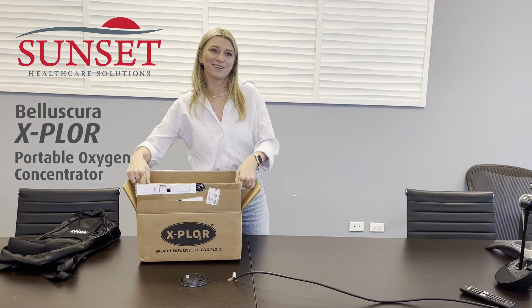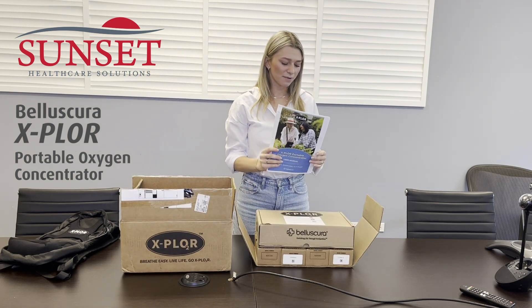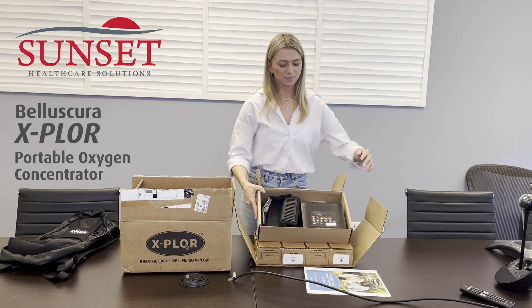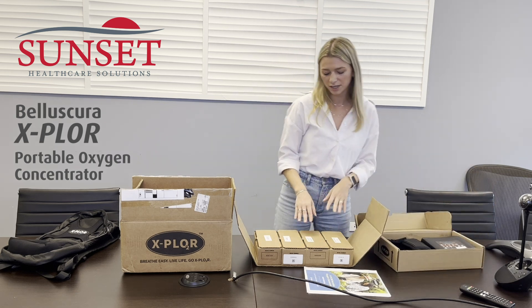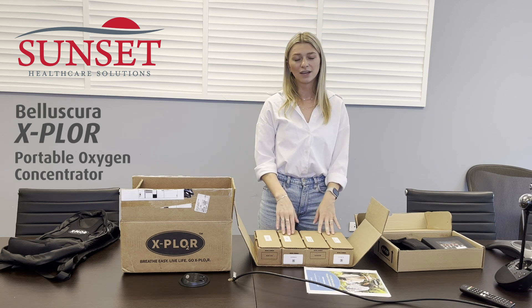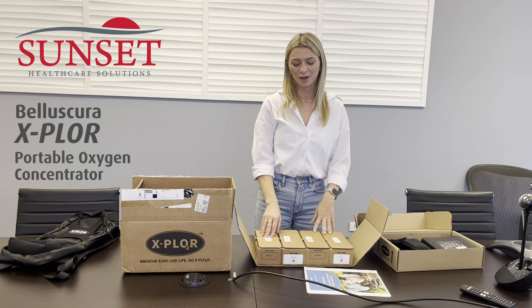This is how the POC arrives. It comes with a user manual and then you've got the main box which contains the unit and a carrying bag. It also comes with neatly sorted boxes — you've got your AC power supply, the AC and DC cord, and the battery. If you do get an extra battery unit, it would have the battery in this fourth box as well.